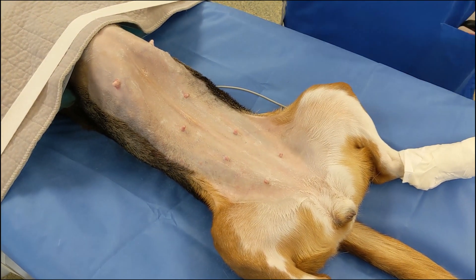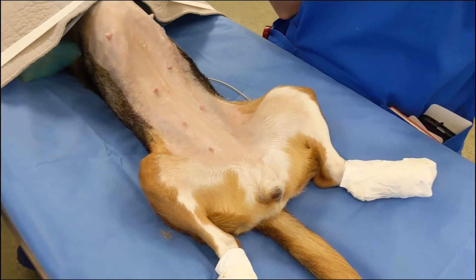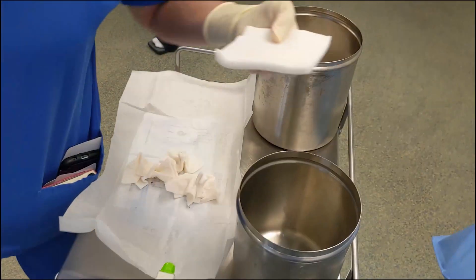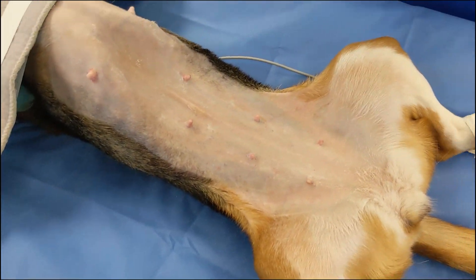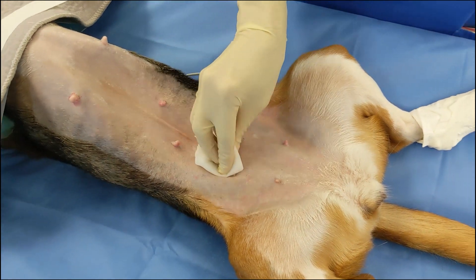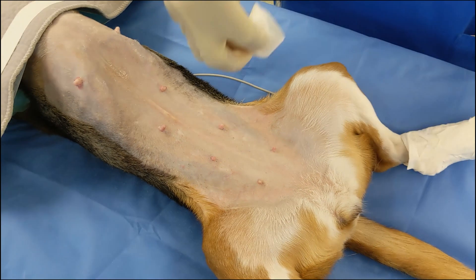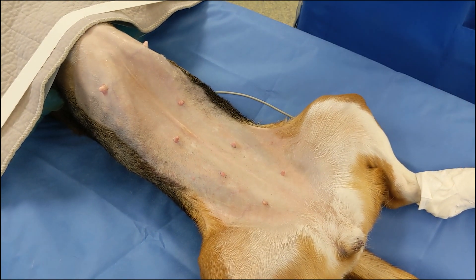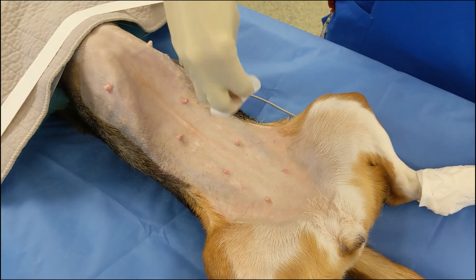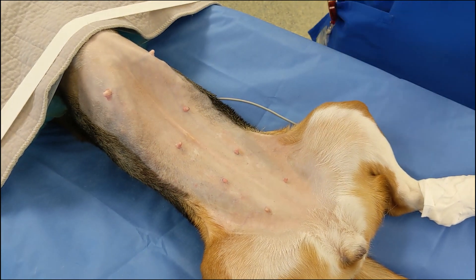We'll typically let the chlorhexidine sit on the skin for about 30 seconds in between rounds of chlorhexidine and alcohol scrubs. Next, the clean hand grabs a stack of sterile alcohol gauze, and the scrub hand uses those gauze to wipe away the chlorhexidine from the patient's skin. You can see gauze always go in one direction once they hit that haired skin — they don't go back towards the sterile prep site unless that edge is rotated to keep it in contact with the haired skin.